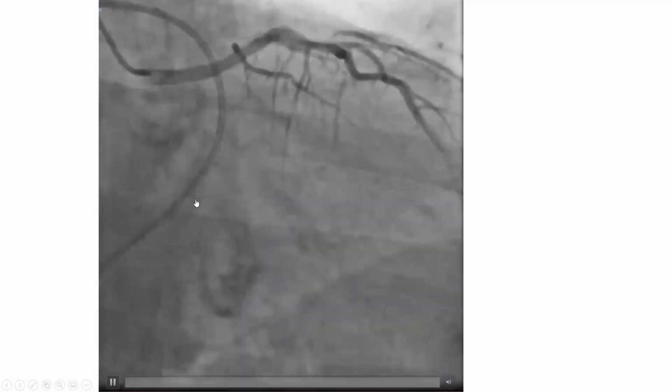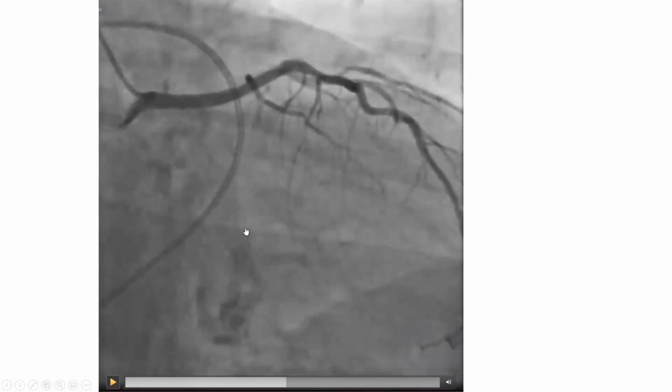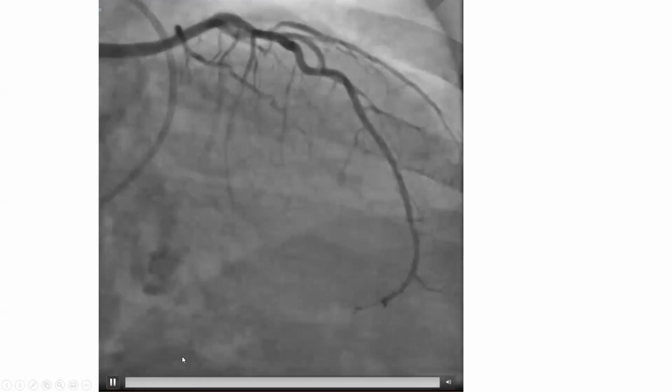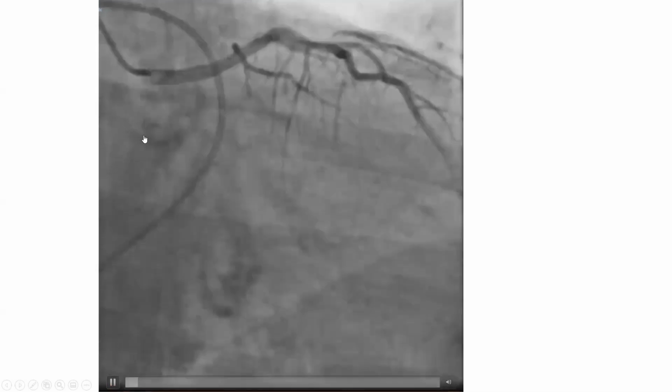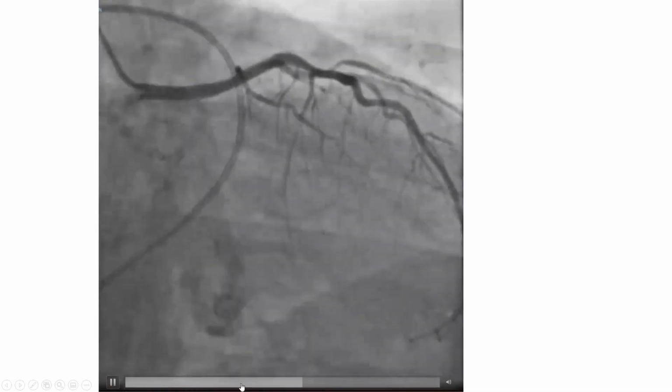Another way, in this particular patient, this patient has a lot of MAC. He has annular calcium that you see here. This is probably posterior annulus and a little in the anterior annulus. So when you have MAC, you don't even need to wait for the coronary sinus. The MAC is in the annulus, it's in the AV groove. So the plane of that MAC would be the plane of the circumflex. Well, I don't see anything in the plane of that MAC, so there is no circumflex, okay? Note here that this is the MAC, and he also has a calcified aortic valve. So MAC is here in an RAO view, and aortic valve is here.